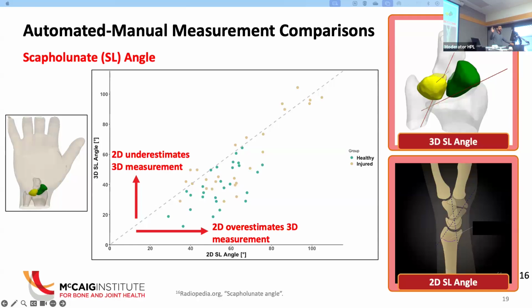Right now, that's what I have with the radioscaphoid and radiolunate angles, but for the actual degrees of rotation itself, the common approach is to normalize to the third metacarpal. That helps us understand the position of the wrist, and how much the lunate is rotating overall. That's our way to normalize it: standardize to the third metacarpal. So I'm assuming those cadaveric studies I used to rely on so heavily were not in a weight bearing position. They were probably just doing this. Yeah, just flexion extension typically.